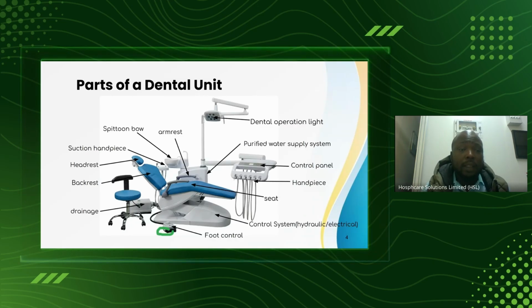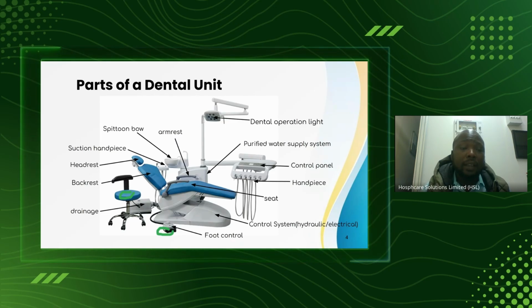This one, at this point here, we call a stool. This is where the dentist sits during the procedure. Normally there are 2, one for the assistant on the other side, and this one for the dentist. Then we have the assistant delivery, this one.